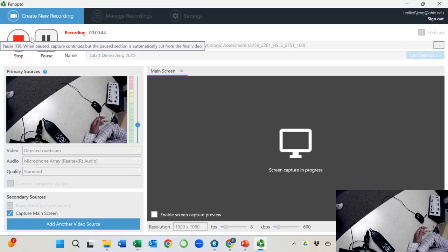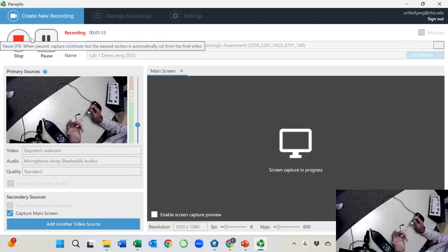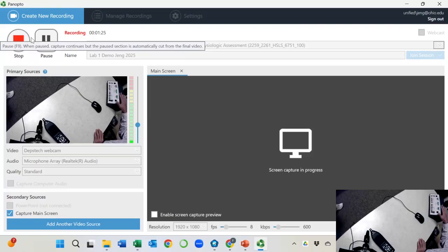But I still think for education and for knowledge, you should know those, not in great detail, but at least watch me doing that one time. Hopefully you have some idea of it, and a few years down the line, when people are calibrating devices in your clinic, you will be able to communicate with them. So when they use jargon, you will be able to understand it. Okay. All right. So the target is to calibrate an audiometer.